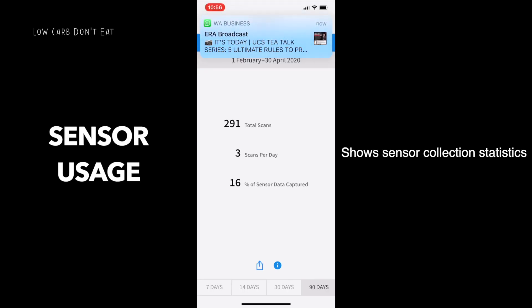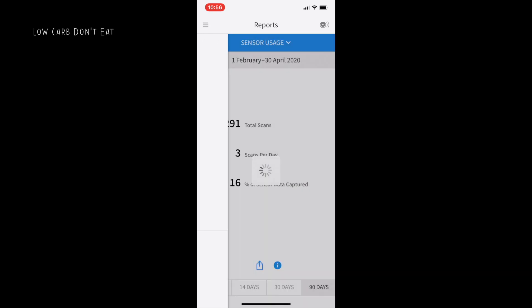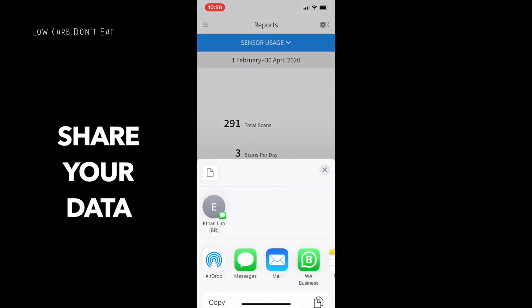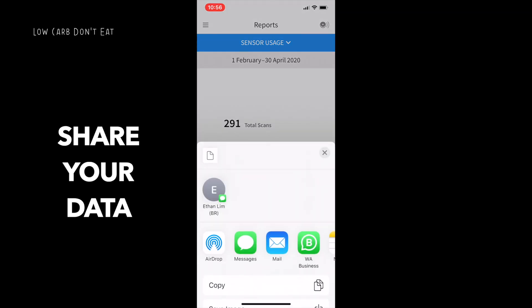Sensor usage shows how many scans you've done throughout the entire period, the average scans per day, and how much sensor data was captured. In my case the figure shows 16% because I had already stopped using it for some time — if I had consistently captured data for the full 14 days, this number should be 100%. If you want to share the information, tap on share and you can send the data via WhatsApp, save it, or print it out for storage purposes.